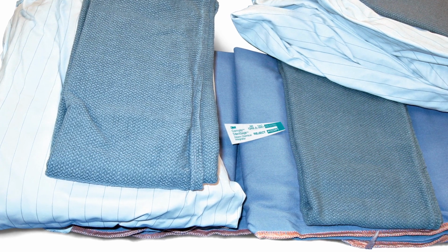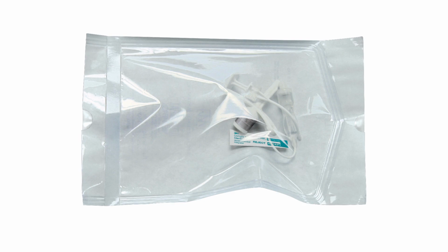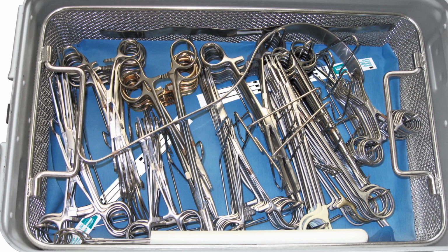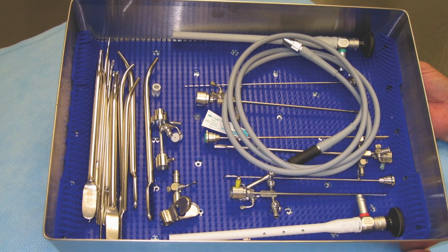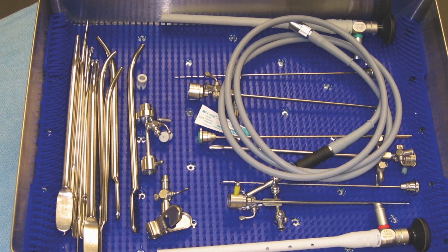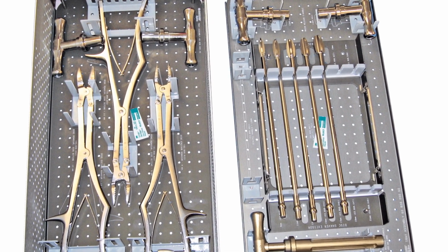3M recommends that you place an integrator in the geometric center of each wrap pack or peel pouch to be steam sterilized. In rigid containers, place integrators in two opposite corners of each level. In multi-level wrap containers supplied by the manufacturer, place an integrator in the center of each level. For containment devices, check the manufacturer's instructions for placement.